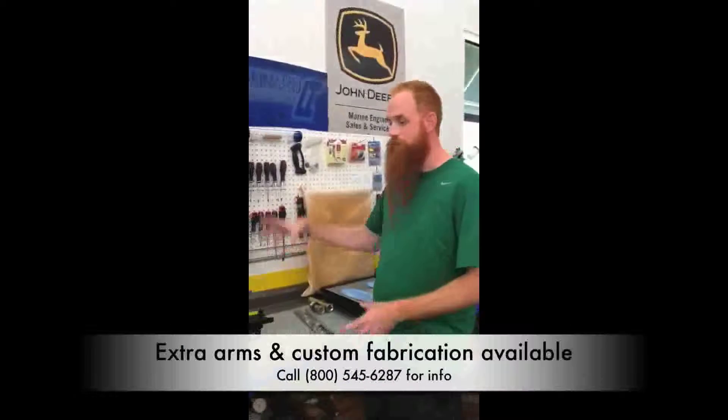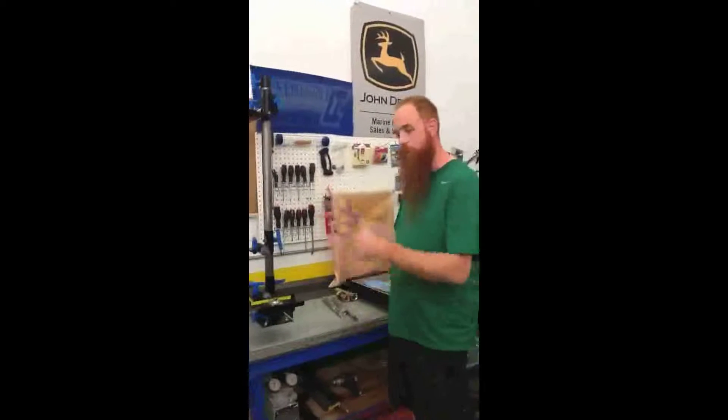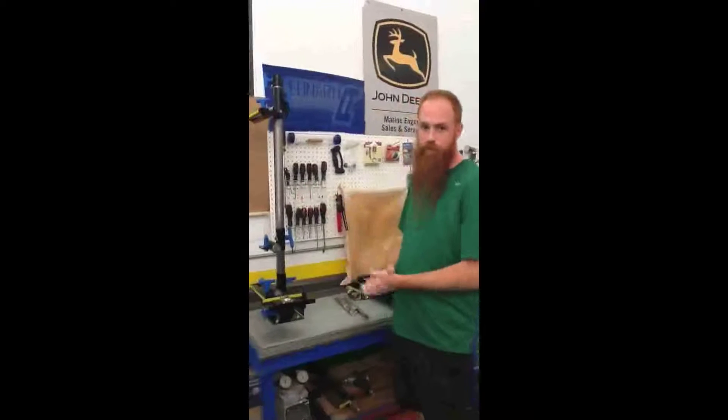We do have extra arms available. We can custom fabricate items, and we have an extra large halo for your larger AK prosthetics.